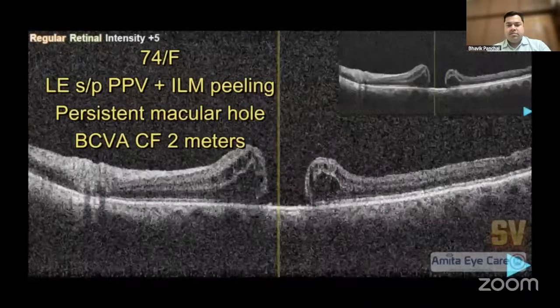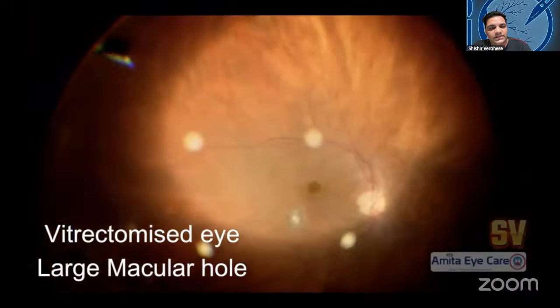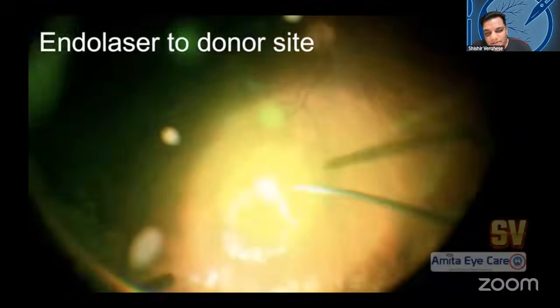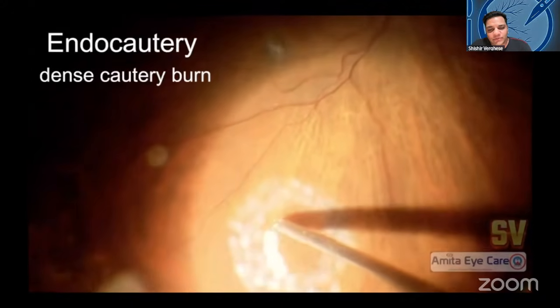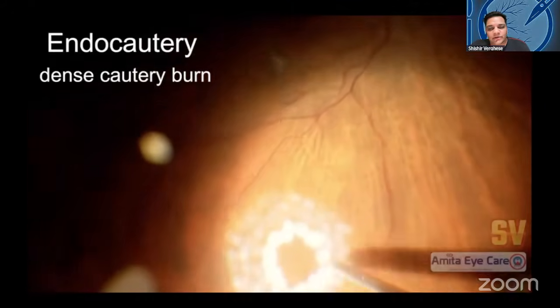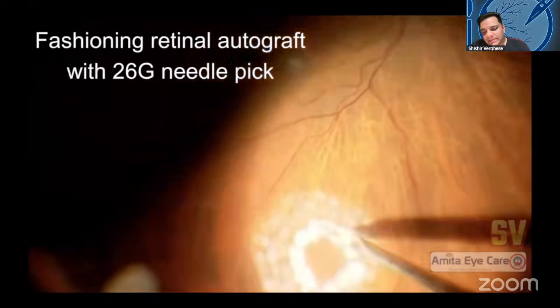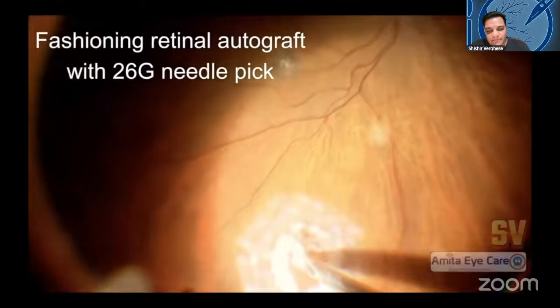Yeah, so this was a 74-year-old who had already undergone macular hole surgery, and even after the first surgery there was still a persistent hole. In this patient, again the issue was the prone positioning and things like that. So I straight away decided to do a retinal autograft. It's quite a large hole also, and there was no ILM remaining within the arcades for me to do a free ILM graft.